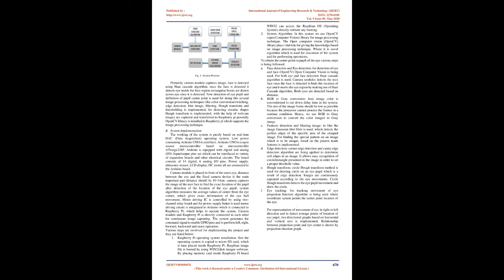12. In this paper, the performance of intelligent wheelchair motion control using eyeball movement signals acquired via electrooculography, EOG, based on a fuzzy logic control algorithm is analyzed. The input EOG signal is obtained from a Ag/AgCl electrode which is conditioned by a g.USBamp amplifier. The obtained signal is fed to the wheelchair, where the eye movement is decided as the direction of the wheelchair, which is fully controlled by the fuzzy logic controller, which decides the plant input for the desired performance.